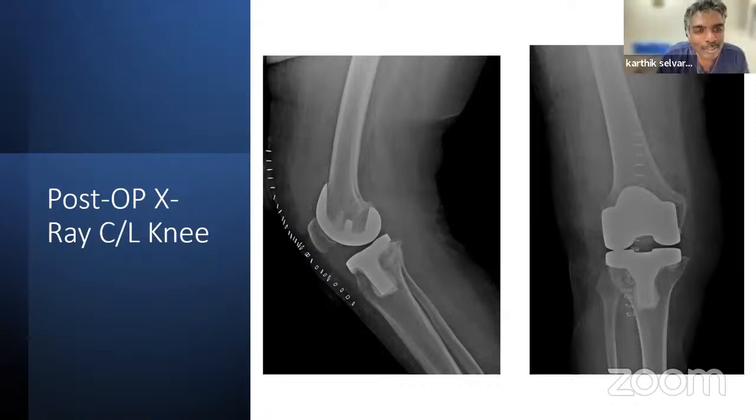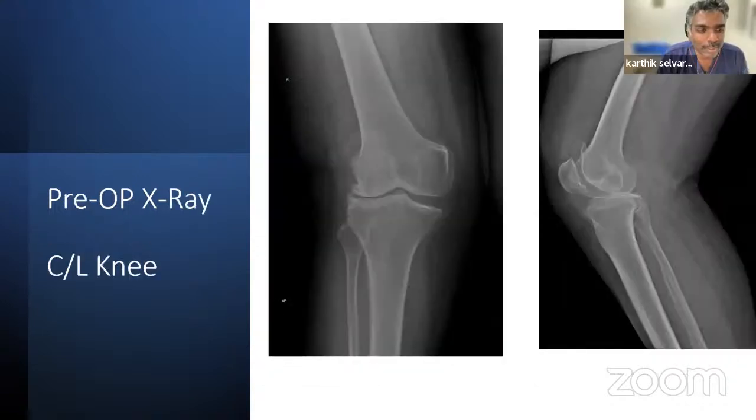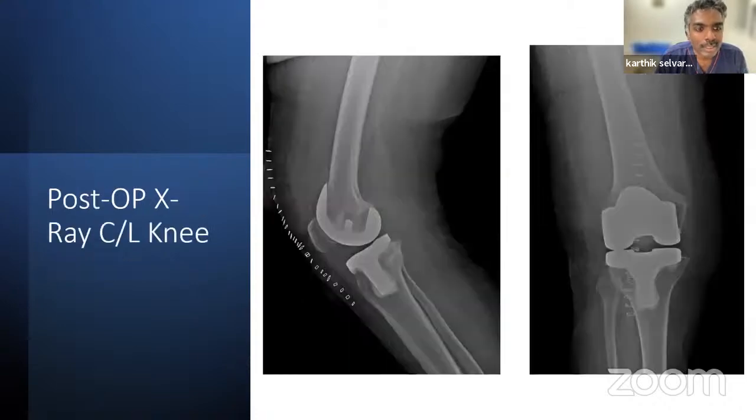One intraoperative thing I noticed was that we had a little difficulty visualizing the posteromedial corner here. You can see that the component is slightly laterally placed. In the lateral parapatellar approach, we didn't actually evert the patella. We just subluxed it and kept it on the medial side. Intraop it looked all right, but on the X-ray I could see some medial uncovering of the tibia. I think you have not done a quadriceps snip. No, I didn't do a quadriceps snip. So that is the thing.